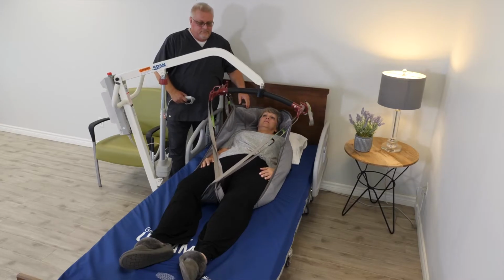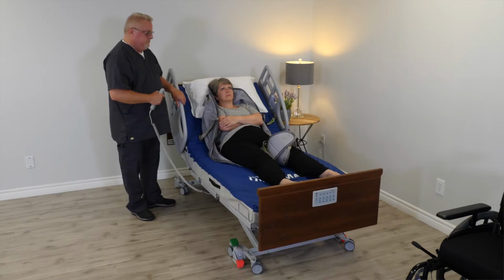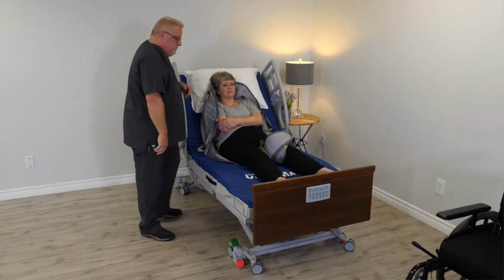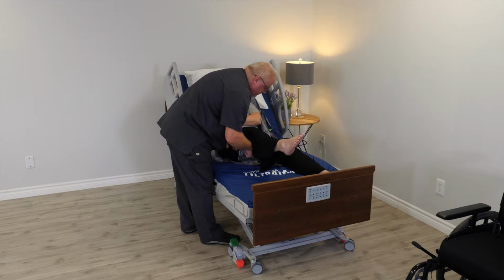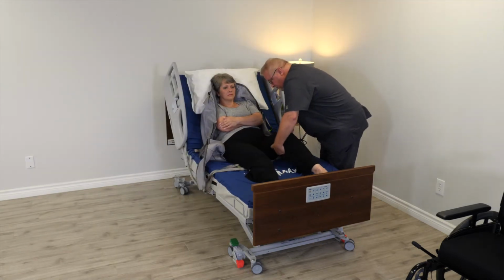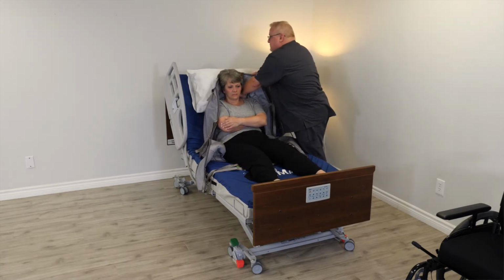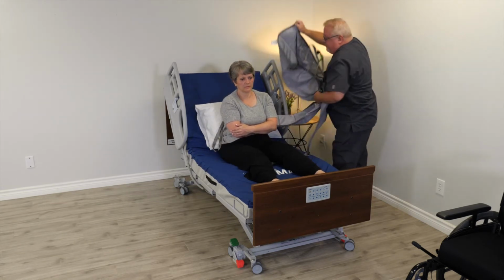To remove the sling, you may log roll or use the head-up function of the bed. For this video, we use the head-up function. Bring the head of the bed up. Remove the leg straps out from under the thighs. Lean the patient forward and pull the sling out from behind the patient. Lean the patient back into the bed.